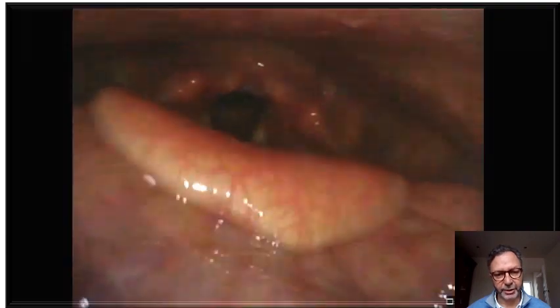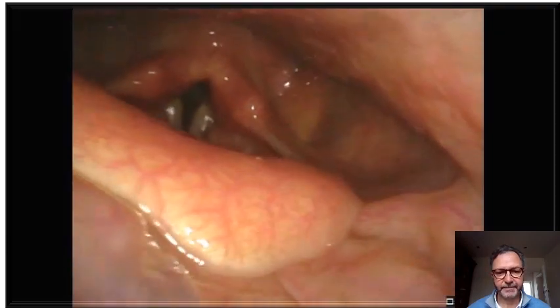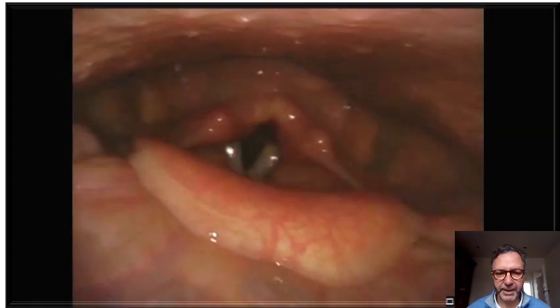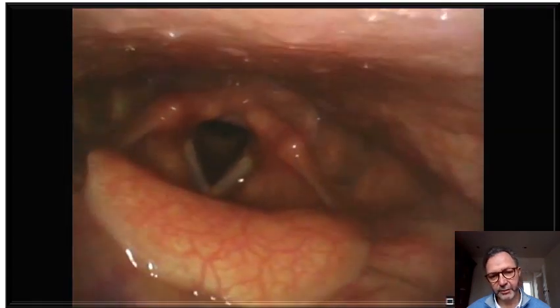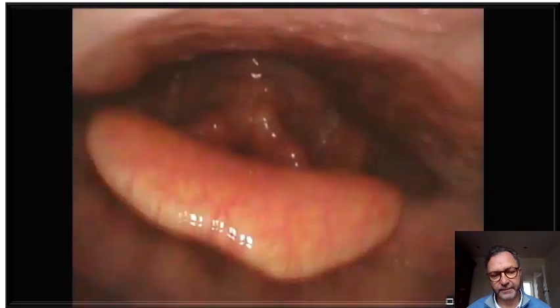a perfectly normal swallow with a perfect pharyngeal clearance and no aspiration or penetration, of course. You can repeat it several times during challenge 4, or assess the sensibility if you want by touching the epiglottis and the oropharynx, which we are doing here, which is perfectly correct with a normal coughing reaction.